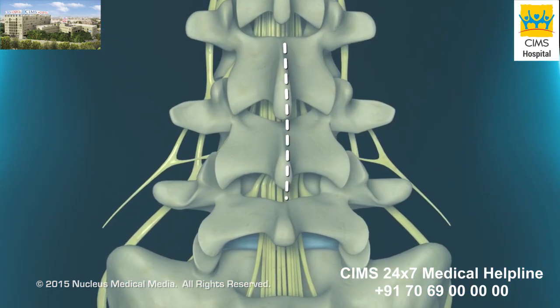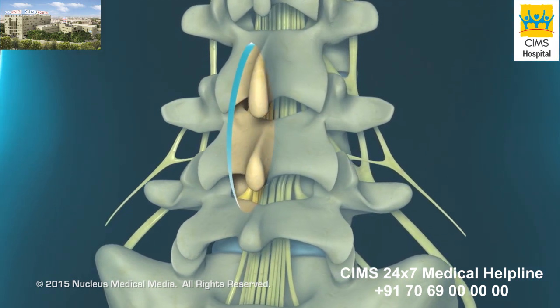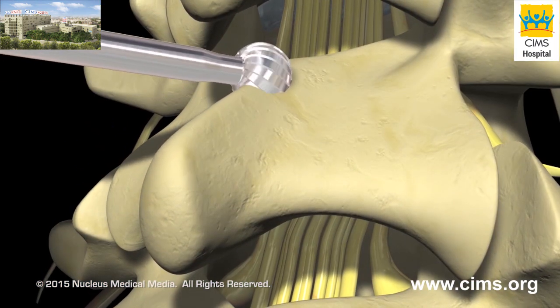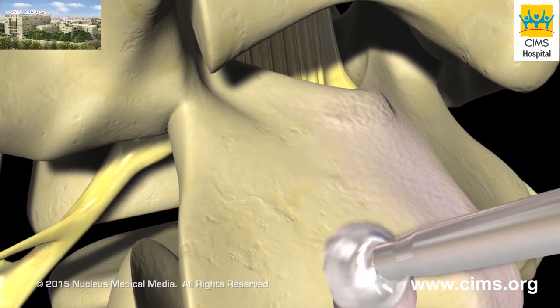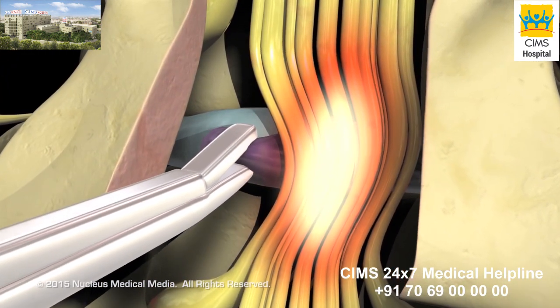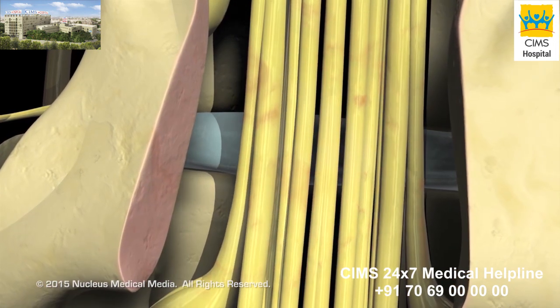Your surgeon will begin by making a small incision overlying your spine. Retractors are used to pull fat and muscles away from the lamina. Using a special bone drill, your surgeon will cut away the lamina in order to see into the spinal canal and locate the source of the nerve compression. If a herniated disc is causing the compression, he or she will perform a discectomy by removing the protruding part of the disc.